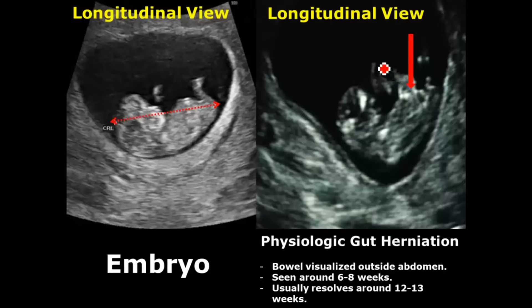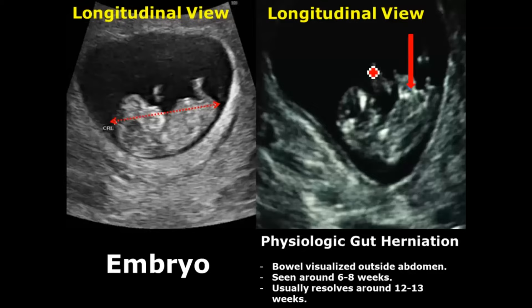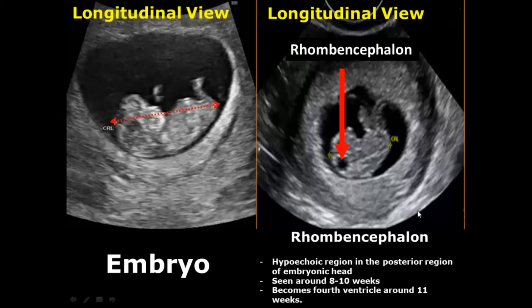Physiologic gut herniation is a normal occurrence in the first trimester. Around 6 to 8 weeks, there is bulging of the intestines of the embryo because the bowel is growing much faster than the abdominal cavity. By 12 to 13 weeks it will return to its normal appearance. Another normal occurrence is the rhombencephalon, seen around 8 to 10 weeks as a hypoechoic region in the posterior part of the embryonic head, becoming the fourth ventricle by 11 weeks.